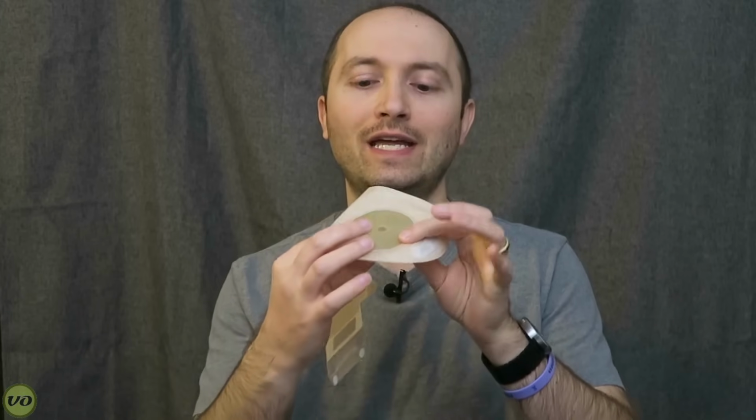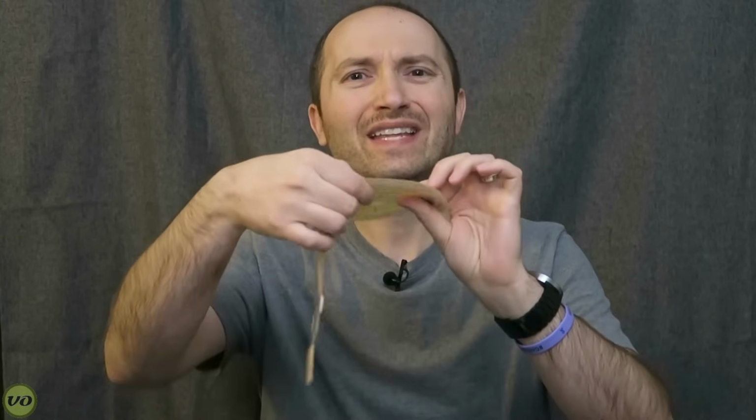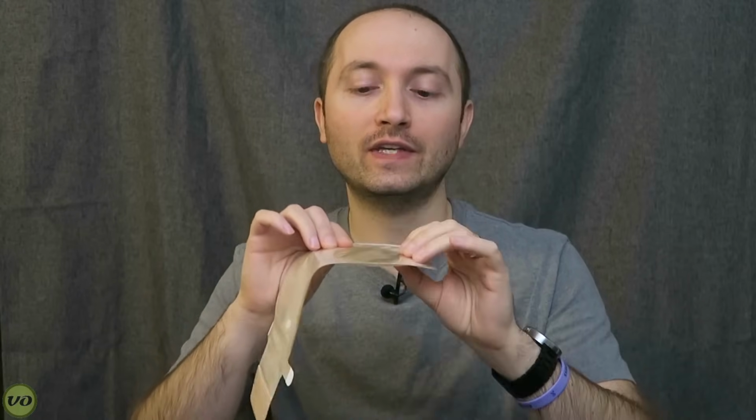Now, one of the benefits of a one-piece system is that because there's no flange connecting the bag to the wafer, it's incredibly thin. You really can't get much thinner than this unless you're going with an adhesive coupling two-piece, which I'll explain later on in the video. The one-pieces are pretty easy to manage. I mean, there's very little you have to worry about other than getting it on.